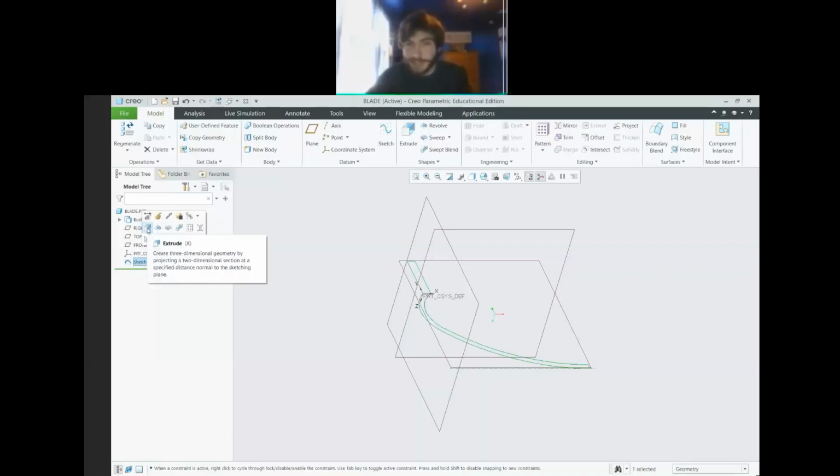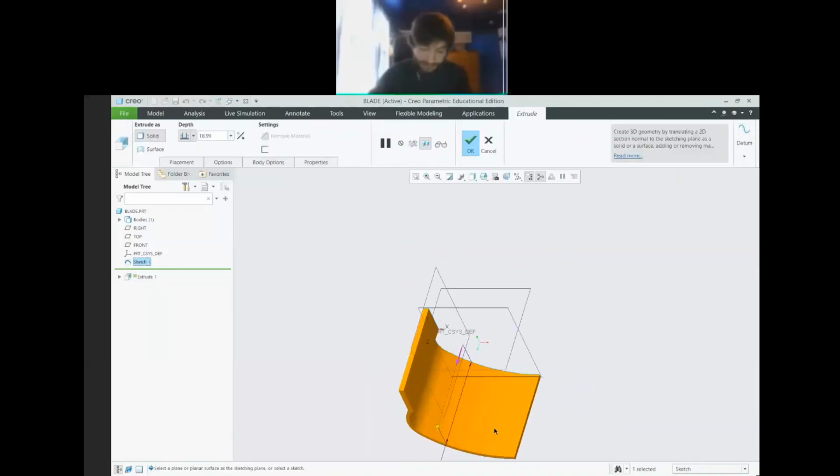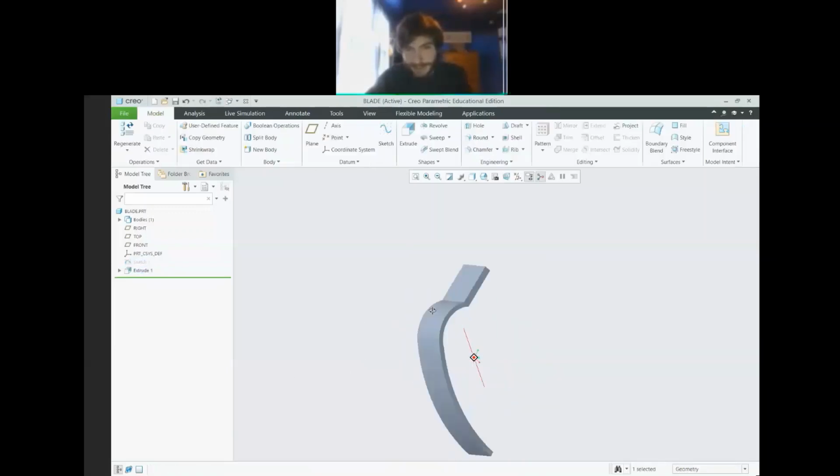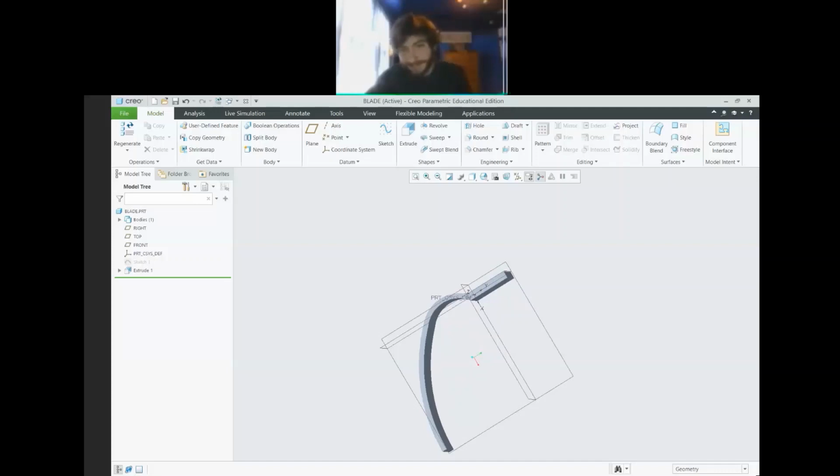And then you can do the extrude button, you can use the shortcut, you can press the extrude button up here, whatever you're fancy. We're going to go ahead and extrude it, not 18 inches, that's sort of insane. Let's do like 5. Right, and so now we have what kind of sort of looks. All right, let's see if I can get the angle right. I mean, it's not bad.